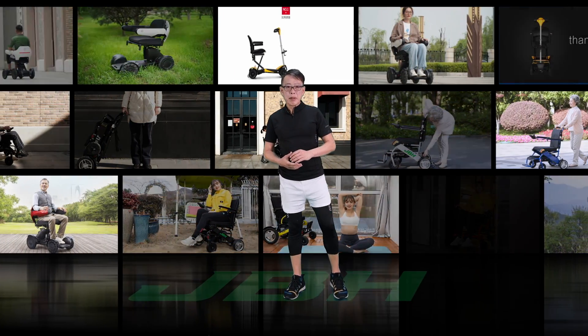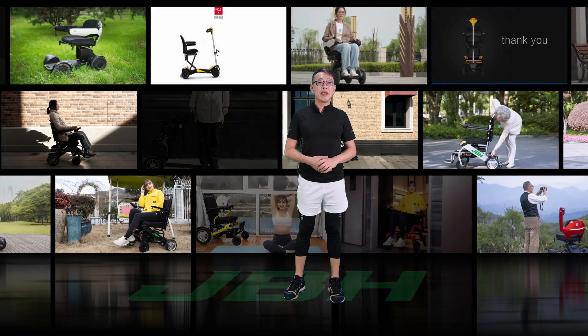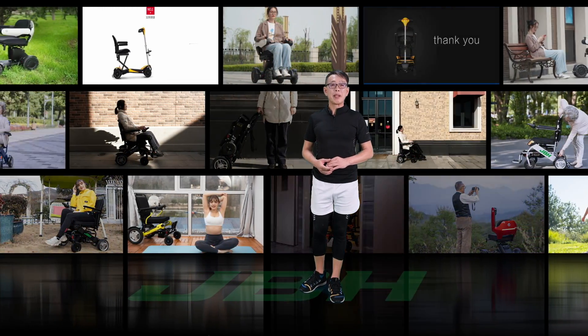Thank you very much for choosing JBH portable wheelchair. Today I'm going to show you how to unbox the DO9C and have an initial setup — it's really simple and easy.